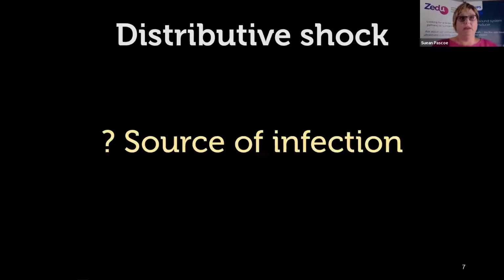And so that's where you don't have enough blood circulating around to the organs. The most common cause, of course, is from trauma or from a GI bleed or an aneurysm. But there are other non-hemorrhagic conditions as well that result in the loss of bodily fluids. So the really popular exam that we all know about that you can use for those trauma patients is the eFAST exam.